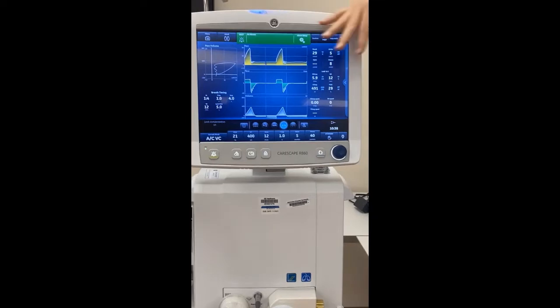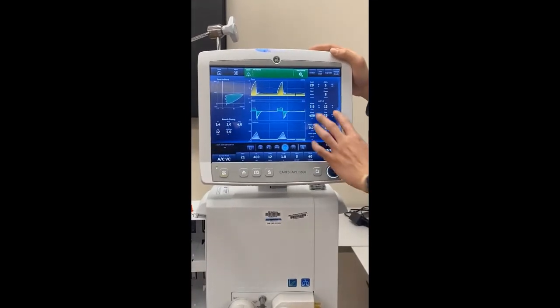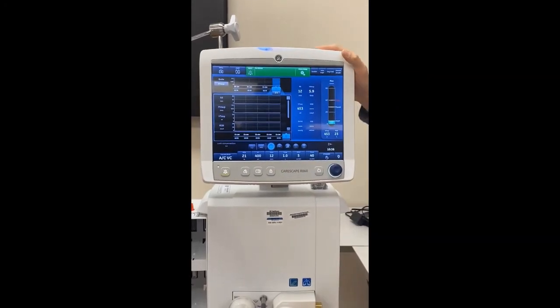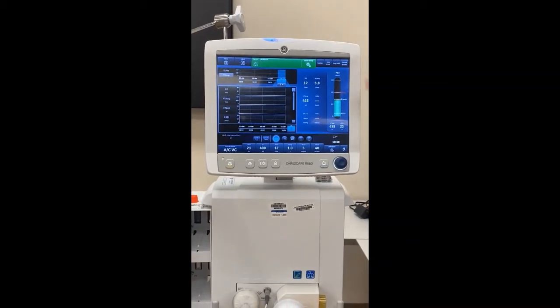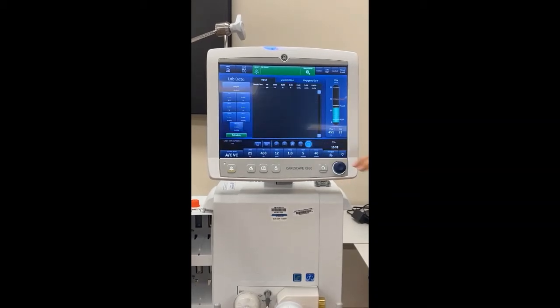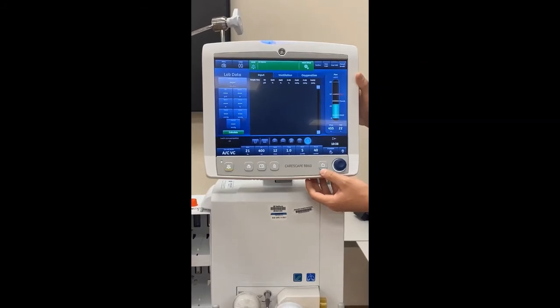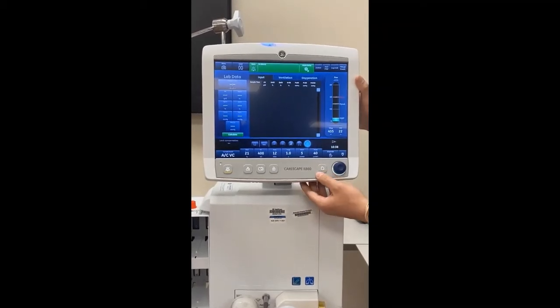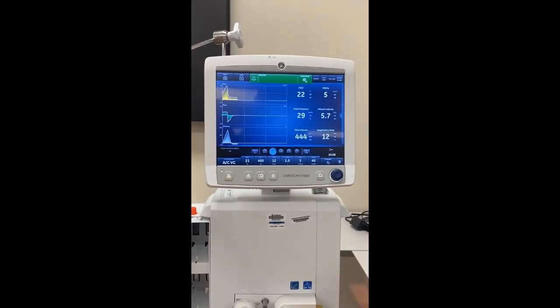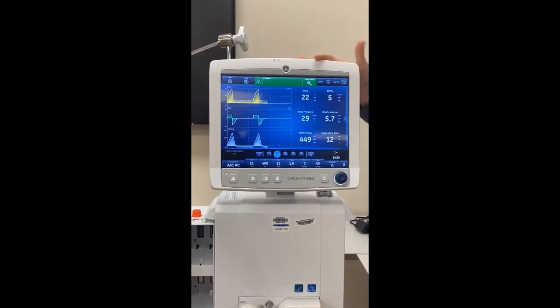In case you are messing with this, or RT happens to mess with it and they do their setting changes per doctor's request, if the screen is displaying a screen that is not familiar to the nurse, or you need to figure out how much volume they're getting and are unable to see that with the current screen being shown, you simply have a home button right here. This home button is just like a cell phone home button that will take you to the front page. By pressing the home button, it will take you back to the home page, displaying the set settings and the pertinent information that we need to see if the patient is doing well.